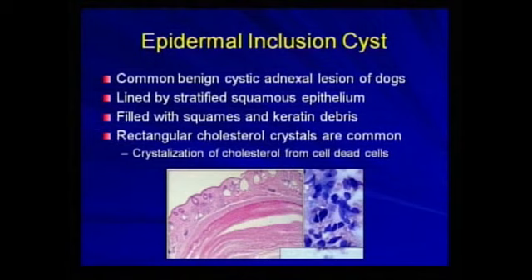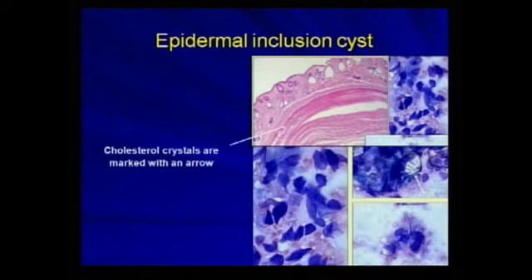But the general appearance of a keratinizing cyst or neoplasm is these flaky looking cornified epithelial cells, which look like this. To me, they look like cornflakes, if you're familiar with that particular cereal. They're angular. It's difficult to pick up their nucleus. Usually they have none, or maybe it's a ghost. And what you're seeing is the keratin flakes from within here.